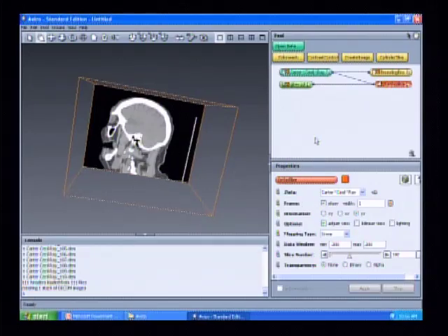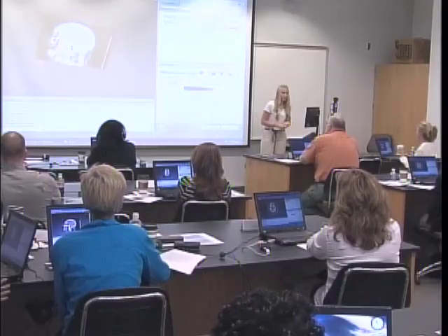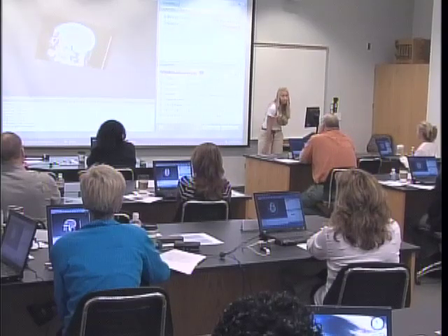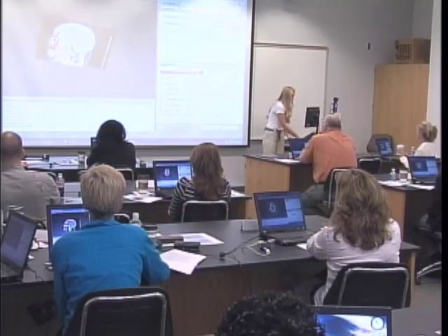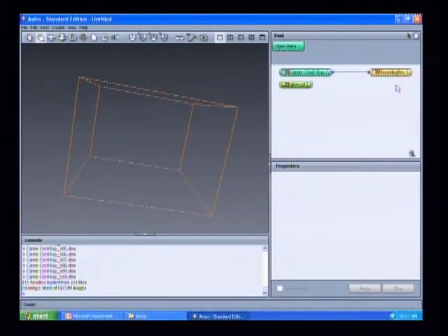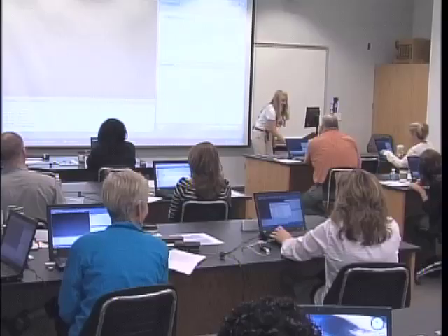So for those of you that did do this, all you want to do is click on these three items that are up there: this glow, bounding box, and Ortho Slice. Once you click on one, you can just press Control X, rather, and it'll remove it. We want to get back to where we were when we originally loaded the data set, so that we're just left with our DICOMs. So everybody just has the DICOMs.